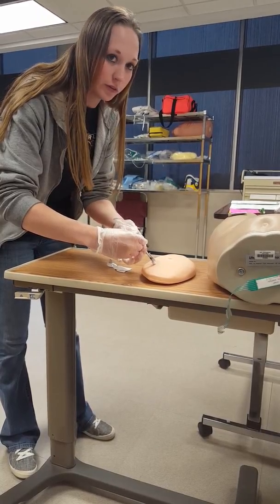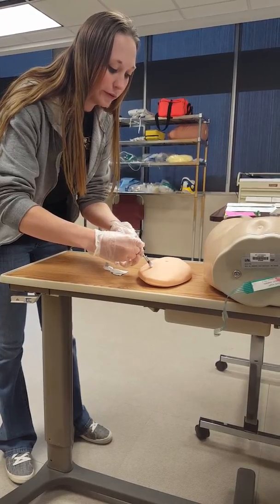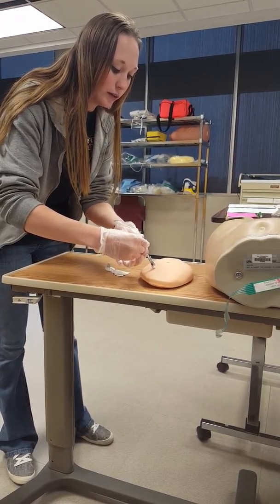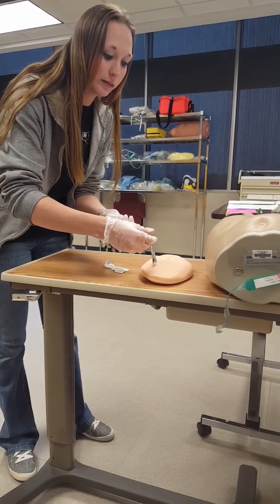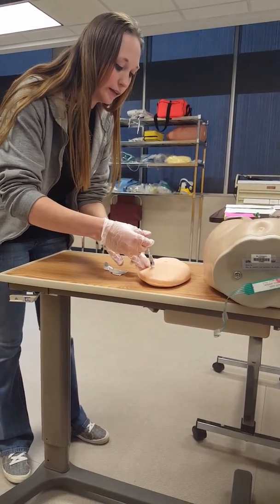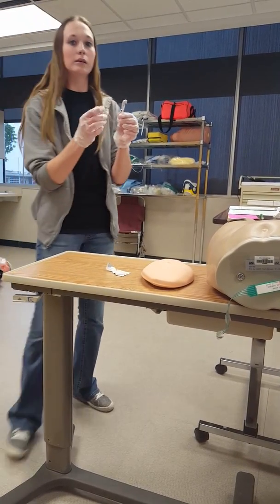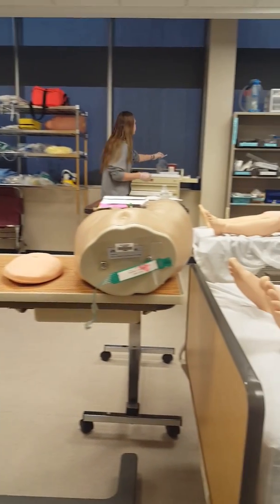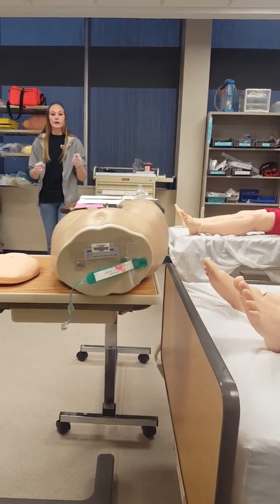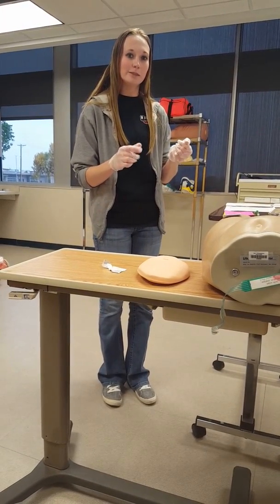And I would just do this over 10 seconds. So I would count to 10. And then I would leave it in there for 10 seconds to make sure all the med gets in there and that it doesn't come back out. And then I would pull out. And then I would lock my needle. I would discard it in the sharps container. And I would ask you if there's anything else I can do for you. Nope. All right.